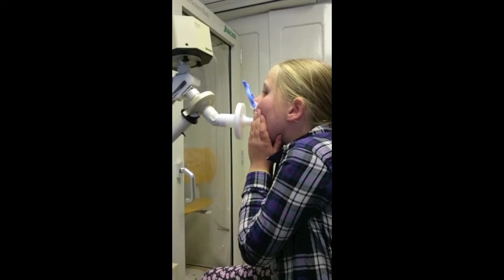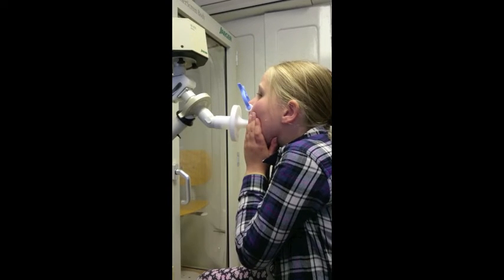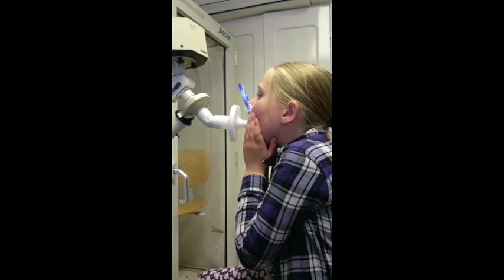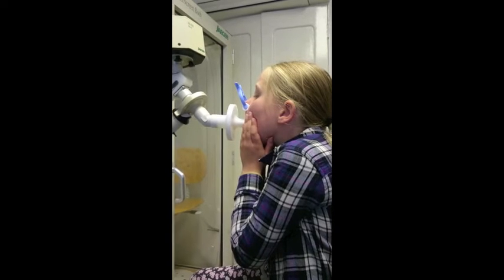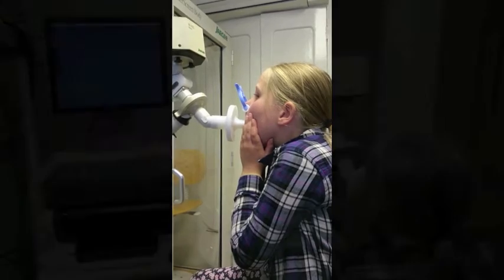Katherine is doing the second test. She has to breathe in and out gently through the machine. The machine makes a popping noise and Katherine can feel the pops in her mouth and her throat. It feels funny but it's easy to breathe.